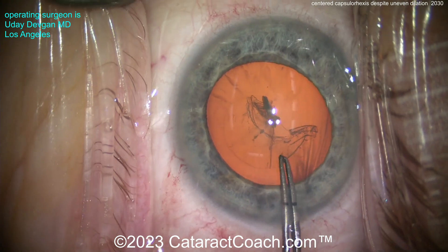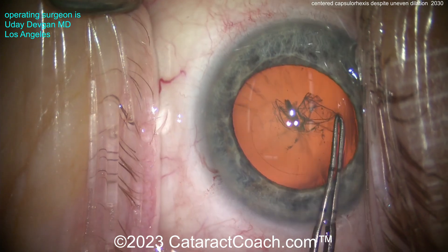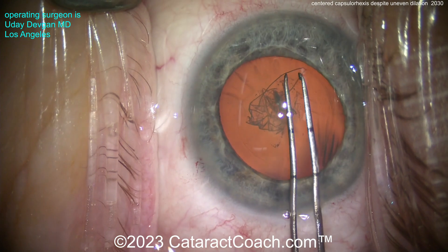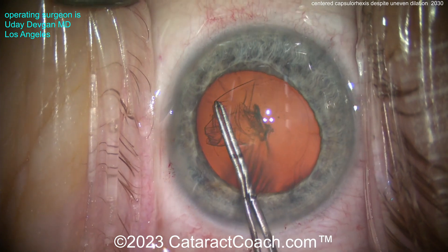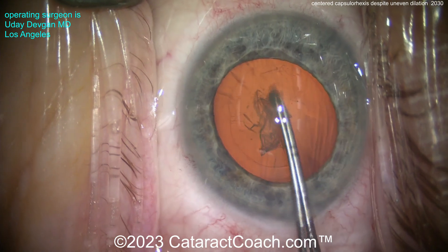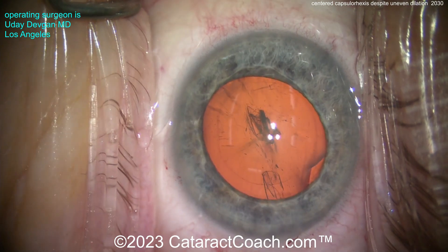Now, the mistake here would be to make the rhexis just following the pupil — no. Watch this. Get that rhexis completed. You're thinking, wait, you're too close to the iris there. But look at the asymmetry — I want the rhexis centered on that lens capsule. Beautiful. Five millimeters measured. You saw it. Just that easy to get the rhexis done.